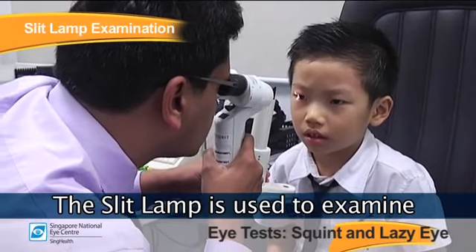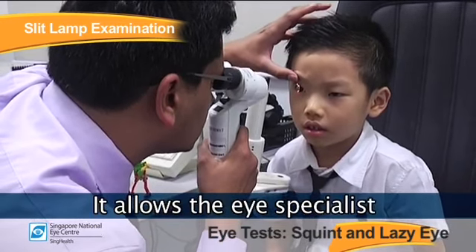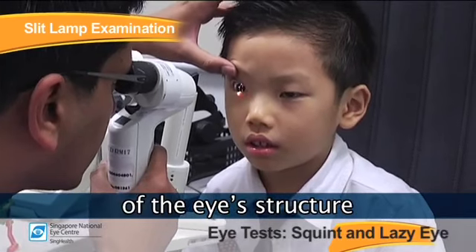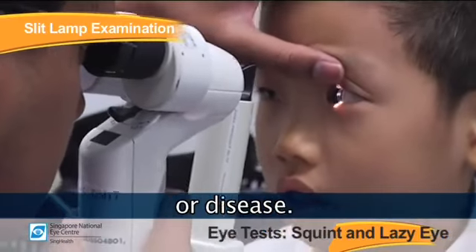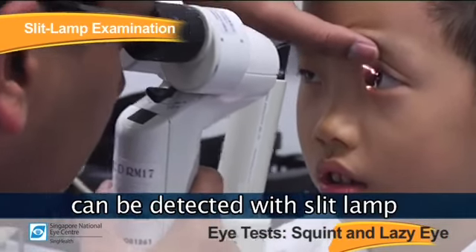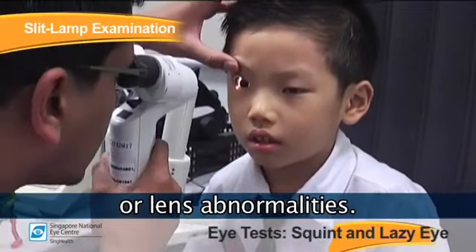The slit lamp is used to examine the front of the eye. It allows the eye specialist to have a highly magnified view of the eye structure to evaluate the eye health and detect any signs of infection or disease. A range of eye conditions can be detected with slit lamp examination, including cornea or lens abnormalities.